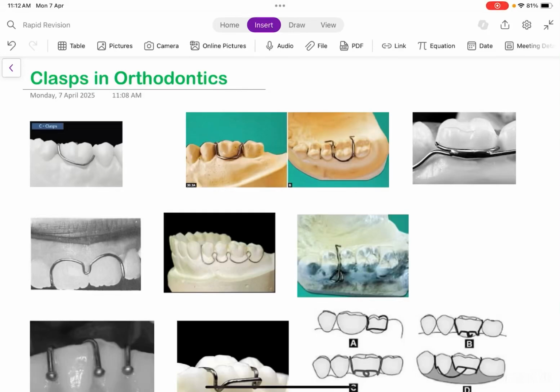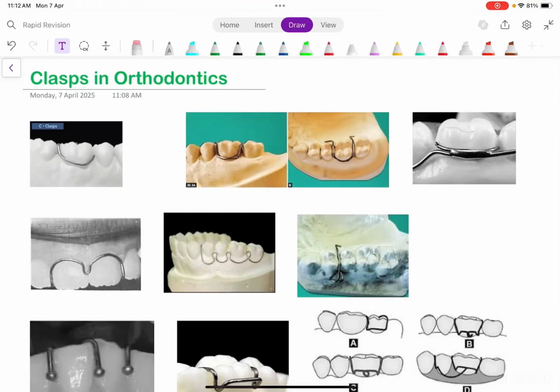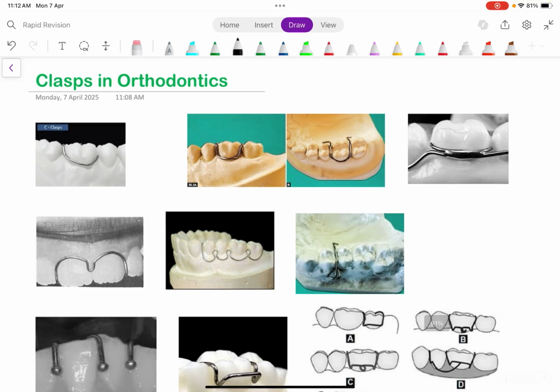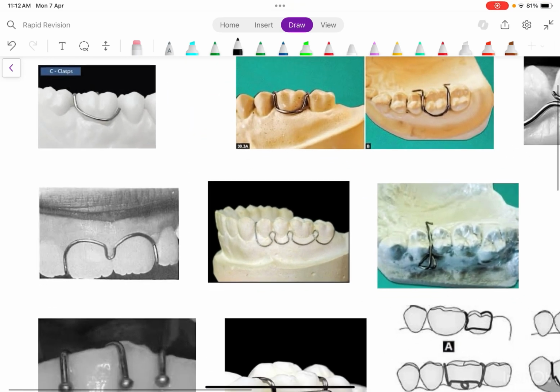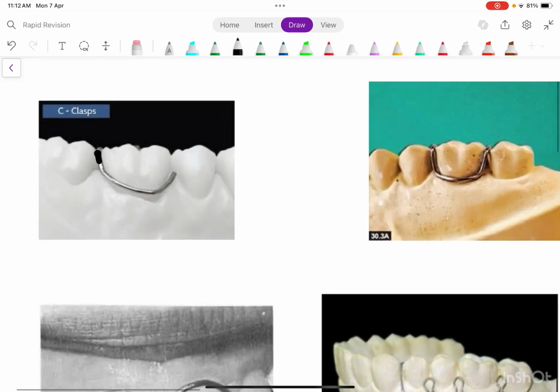So in this video I'll be talking about clasps in orthodontics. So first of all, you should know that a clasp is basically a retentive component in the removable appliances. Alright, so starting from the first one, this is the C clasp. You can see it forms a C.